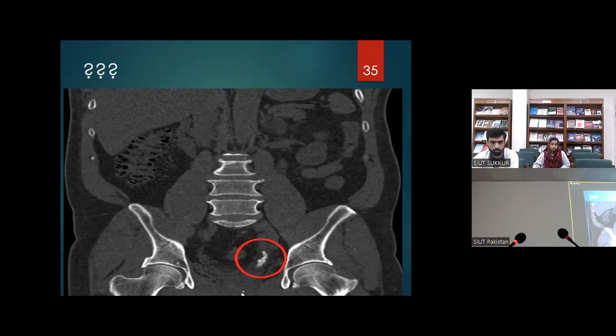For instance, maybe somebody will say that the patient can be done in prone position. You will do another session of ESWL by filling up the bladder and then doing ESWL for this Steinstrasse. It will clear on its own. Maybe the other person comes into the room who is a very enthusiastic person. He will tell you that no, this patient should be for URS. I'll put in a URS, clear off all the fragments, put in a DJ stent afterwards, taking out the DJ stent after maybe 2, 3 weeks.